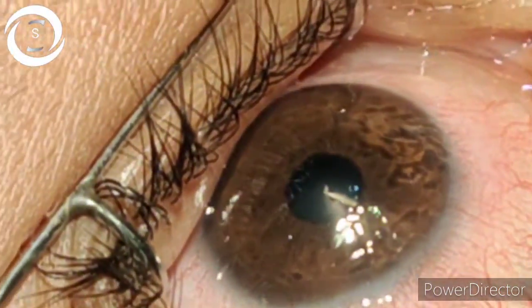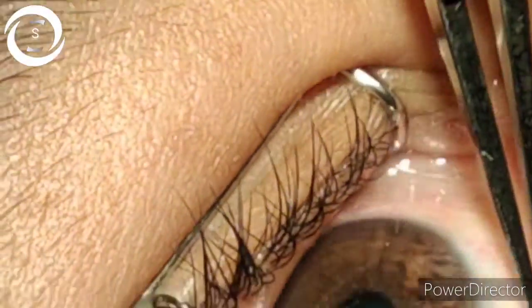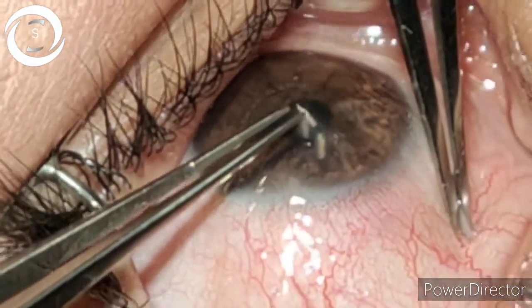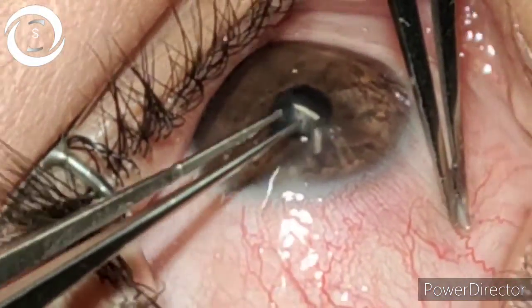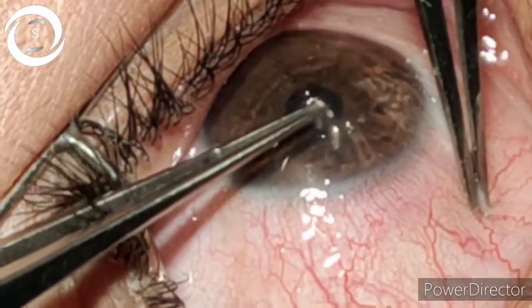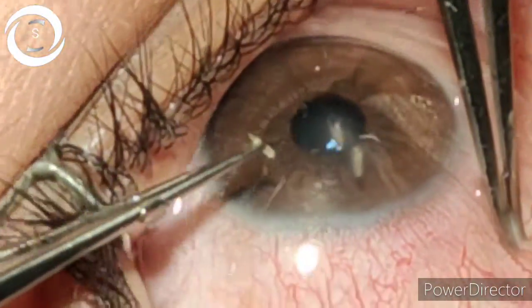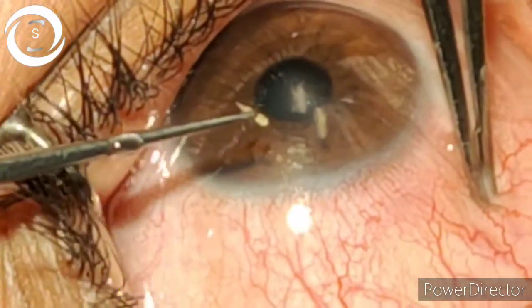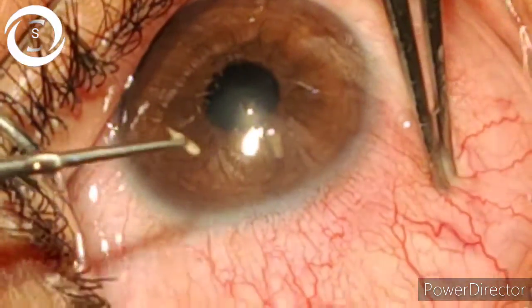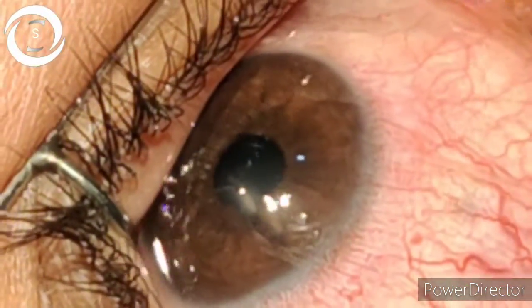With the help of corneal forceps I will remove it. You need to have two forceps — with one you have to stabilize the globe, because the patient is young, eight years old, and under topical anesthesia, so he will move his eye. You can see a very sharp thorn — we have removed one.